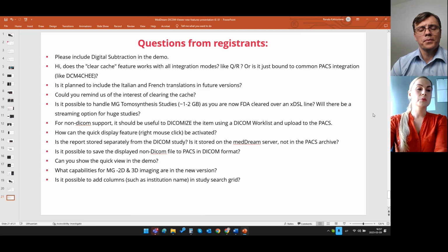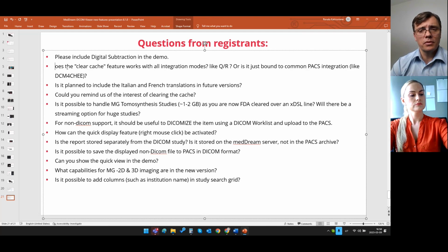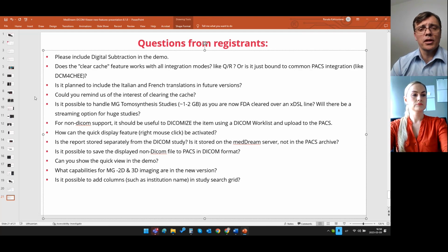Thank you. So we have questions we got during the webinar. The first one is, please include digital subtraction in the demo. This is a very good hint, and we're working on applying new data sets for our demo site to allow you to see subtraction. This is what Renata already has in the task list.